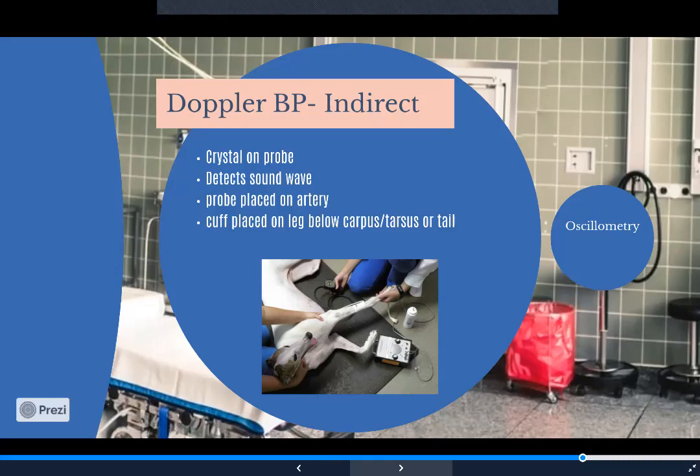So that is now the directions that they have given us. ACVIM has said, yes, we want you to take serial blood pressures and ideally take 7 of them throughout the first 2 because they can be a little bit weird at times. And then you have 5. So take as many as you can. You could take 5, you might have to throw out a couple of them and then average out 3. It kind of depends on what your hospital decides.